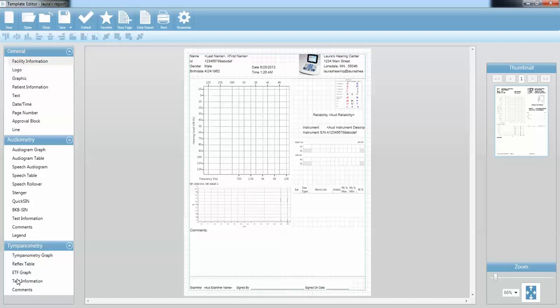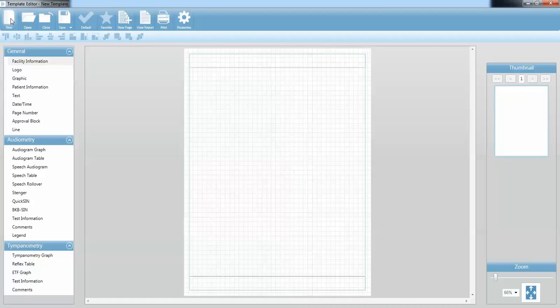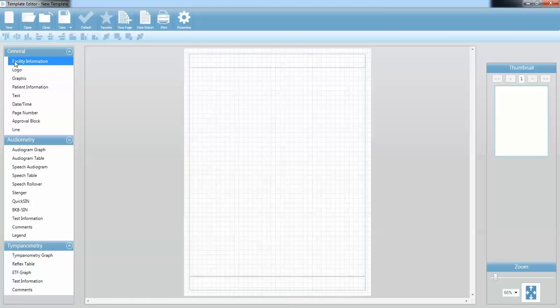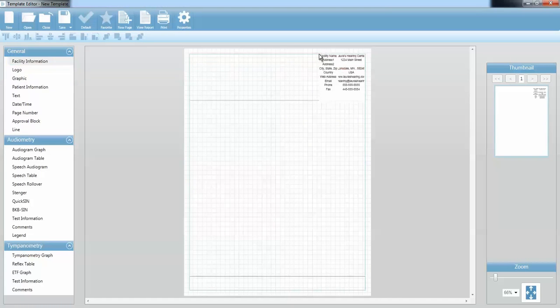You can modify the report that you have copied and edited, or you can create a new report. I'm going to create a new report just to demonstrate the ease with which you can pull in information. In my report, I need to have some facility information, so I'm going to take this first facility information component, click on it, and drag it over to my report. You can see that it's kind of small, but I can adjust that.